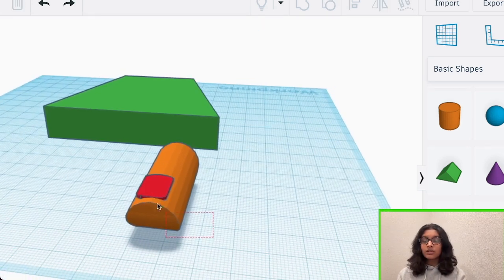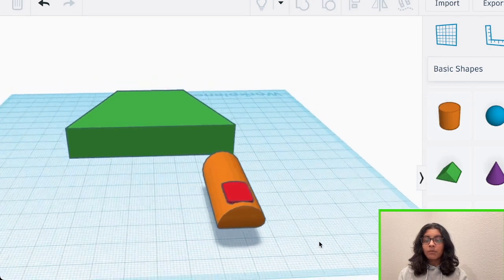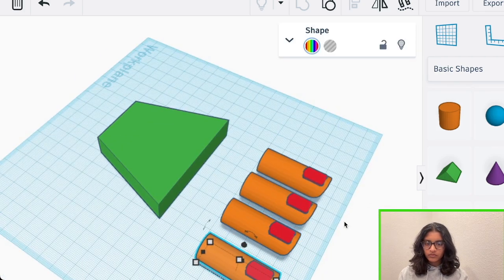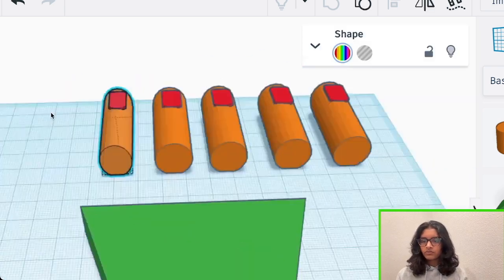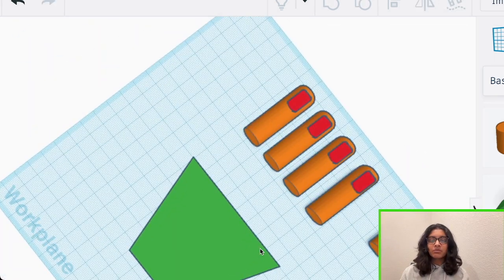Alright, so after your finger design is done, we're just going to group all of these together, and we're going to copy and paste them 4 more times to make each of the other fingers. Now you can kind of adjust the sizes of your fingers based off of what looks most realistic. I'm just going to make a few of my fingers thinner and make the thumb a little bit thicker to match with the size and shape of my own hand. After this, you can adjust the spacing and placement of your fingers to match more of the hand.